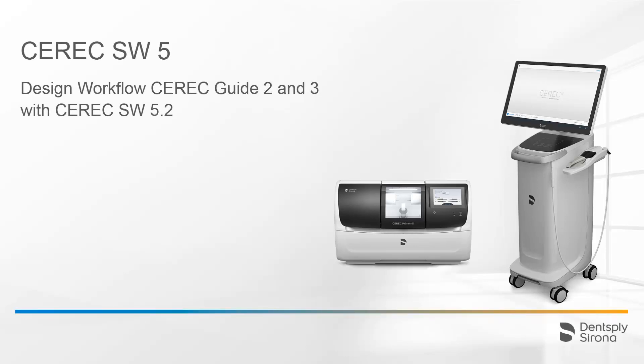Welcome to this video tutorial on the topic of CEREC Software 5. In this video, we demonstrate the design workflow for a CEREC Guide 2 and 3 with the CEREC Software 5.2.